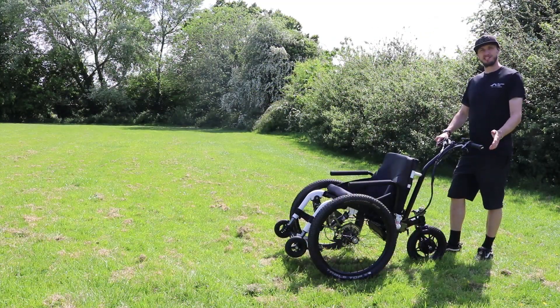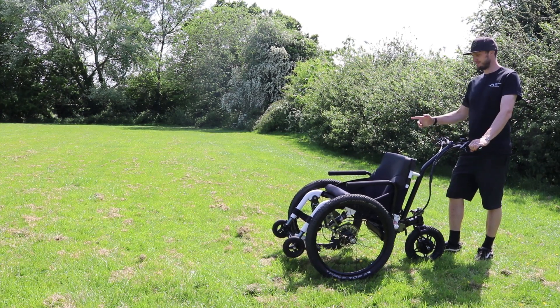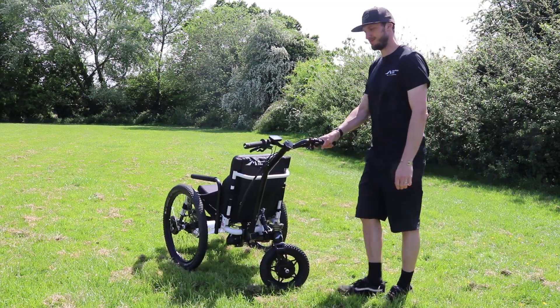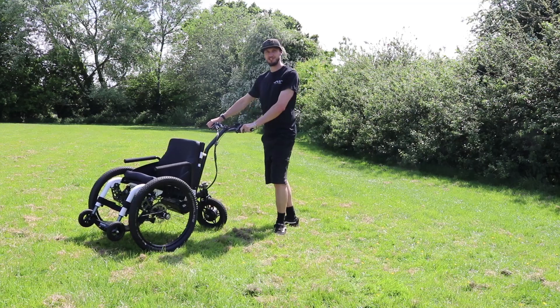You can also use the brakes to help you start a turn. Simply pull the brake lever on the wheel on the inside of the turn. So to turn right, pull the right brake lever and push the handle to the side. And to go left, pull the left brake lever and push the handle to the side.